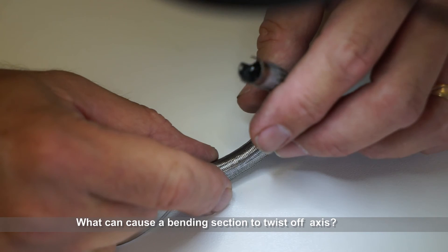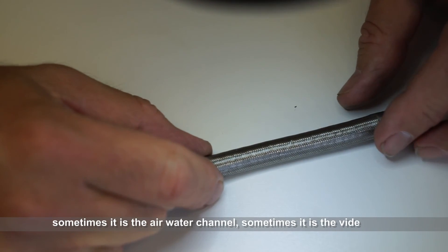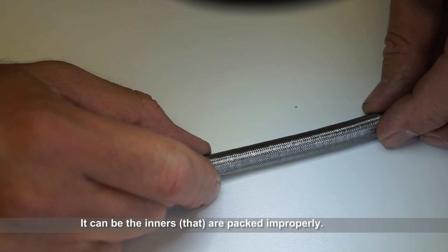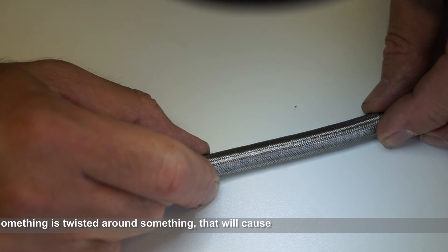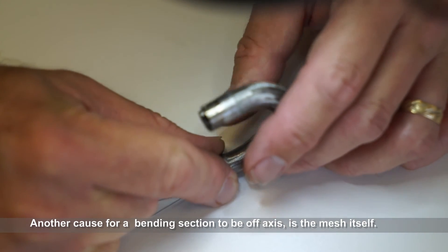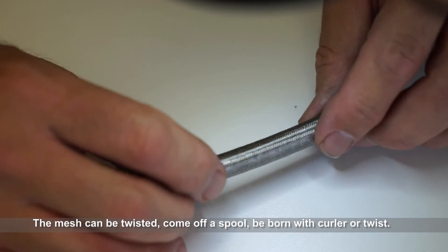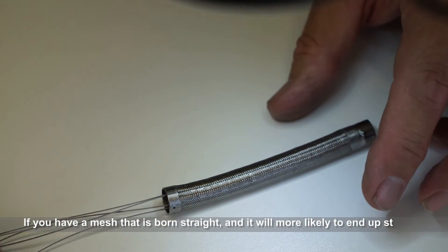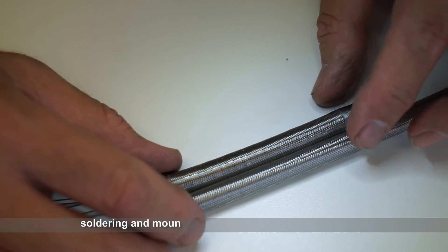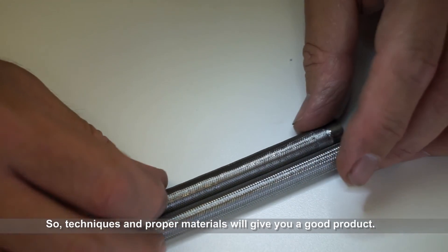What can cause a bending section to twist off axis? The main cause is usually the biopsy channel, sometimes the air water channel, sometimes the video cable. The innards may not be packed in properly — something twisted around something — and that'll cause a bending section to twist. Another cause is the mesh itself: it can be twisted or come off a spool already born with a curl or a twist. If you have a mesh that is born straight, it will more likely end up straight. There are also problems with technique and soldering when mounting the mesh — you can put a twist into it. Technique and proper materials will give you a good product.